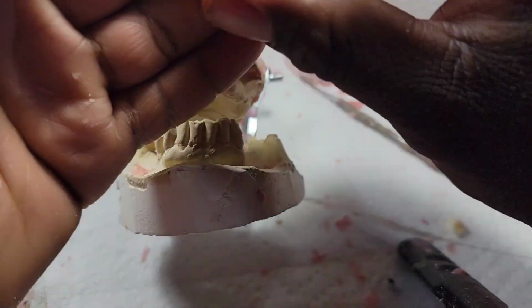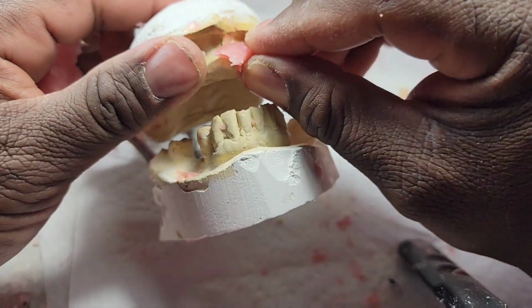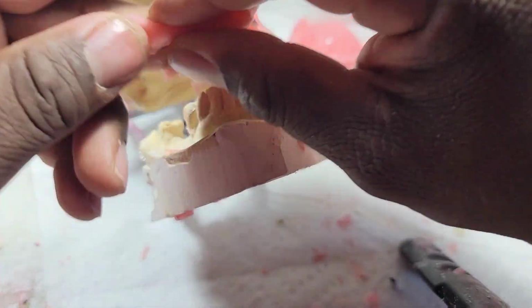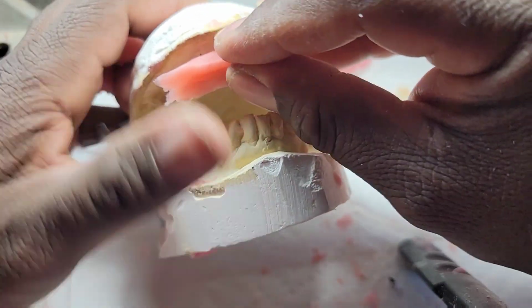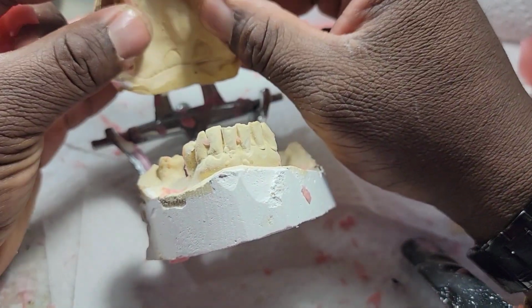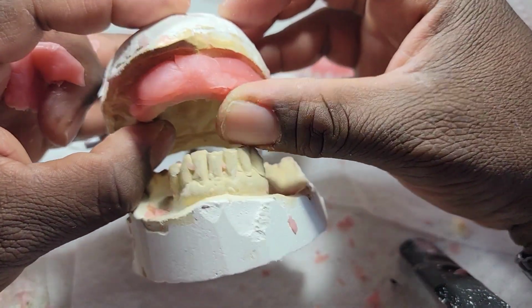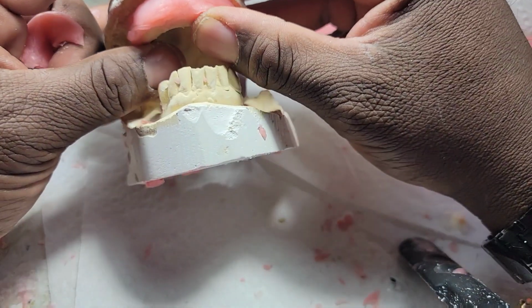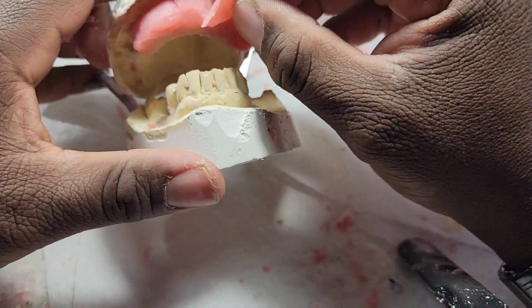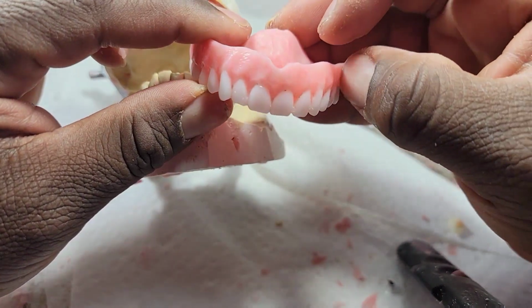What happens in lip support? You see this here? Lip support is adding wax next to the bone. You see? There is the bone here, and adding wax around. You will feel this around your nose. You will feel that all on the skin and the top of your nose when the denture is done, on that area of the denture, right here.